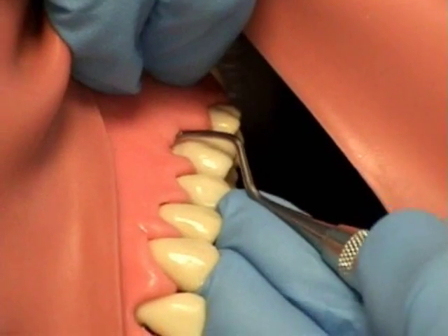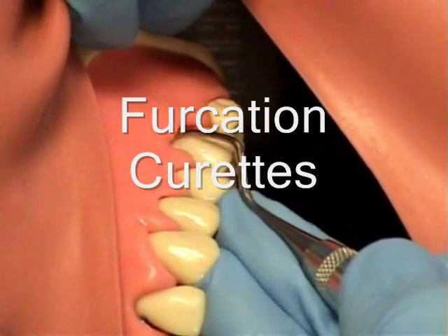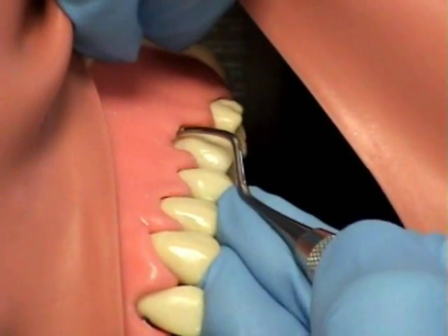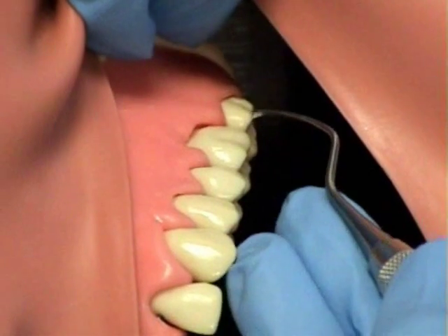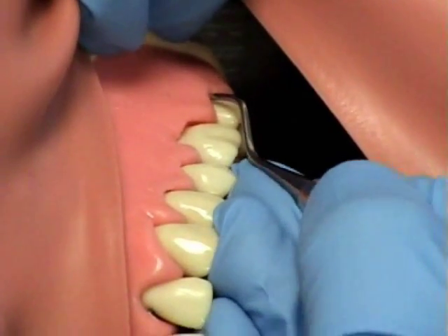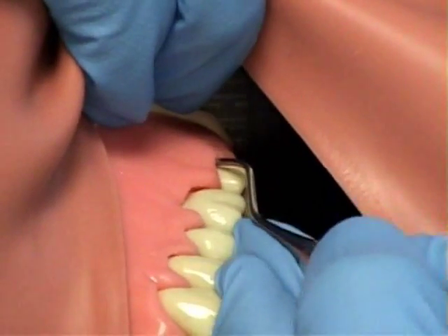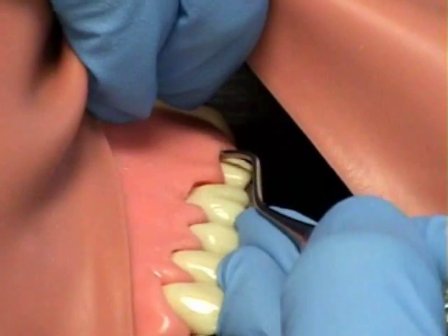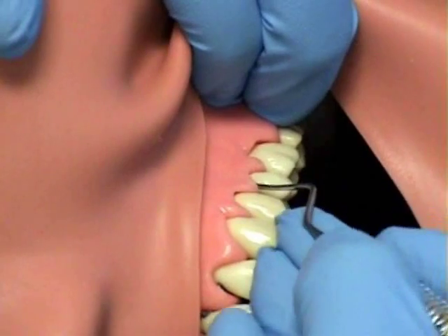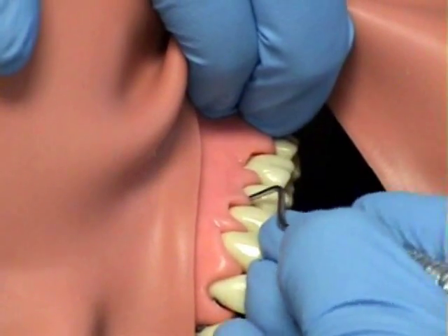Furcation curettes are designed for scaling root concavities and furcations. They are available in buccal and lingual or mesial and distal designs. The blades come in two sizes, 0.9mm or 1.3mm. This cleans the area between the roots. Furcation curettes are very helpful for those class 1, 2, or 3 furcations.